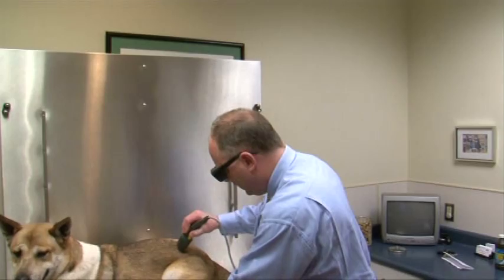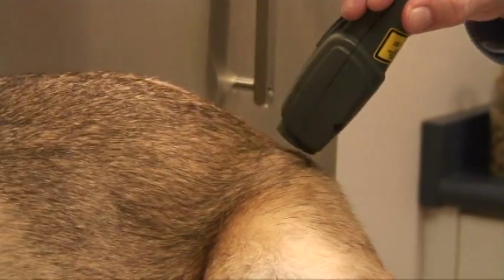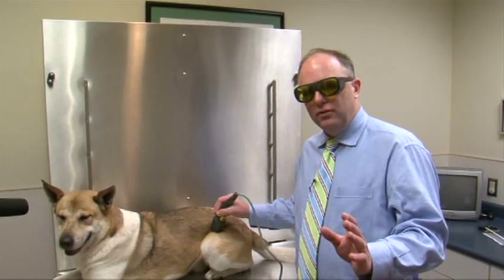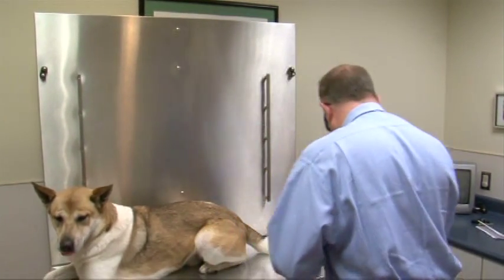When I begin the treatment, I'll be at the first area for 30 seconds, then here for 30 seconds, here for 30 seconds, then I'm going to come down — 30, 30, and then the remaining 30 seconds.